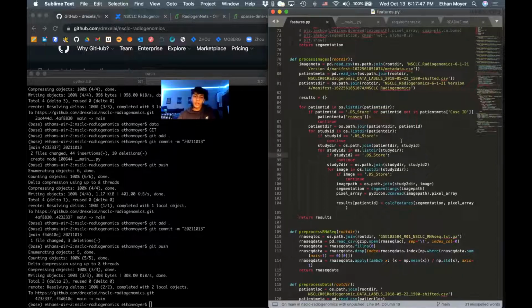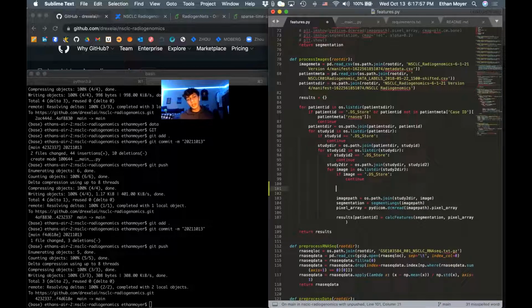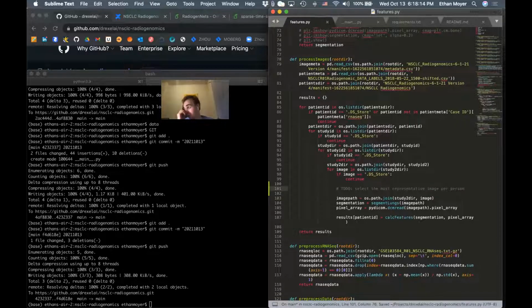There's this algorithm called refine nets, like U-Nets, and they are pretty cool. They do the segmentation and they give you the best image. I don't know. We don't need the best. We need the most representative. Yeah, I mean, best as in the stack of their collection, the slices, the best slice.